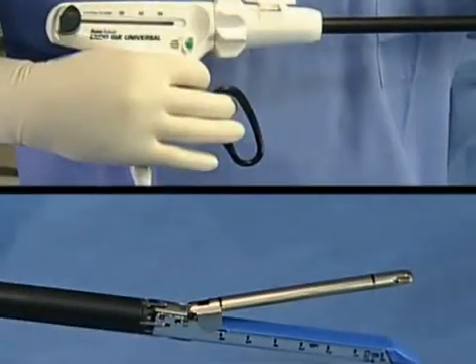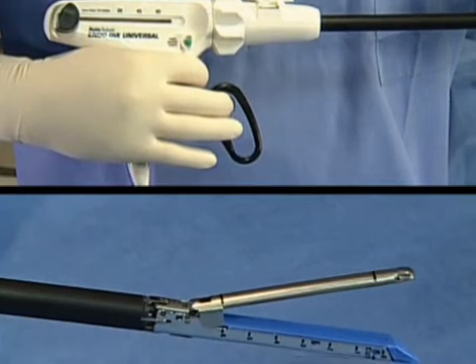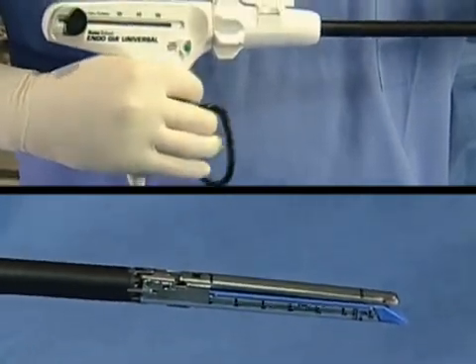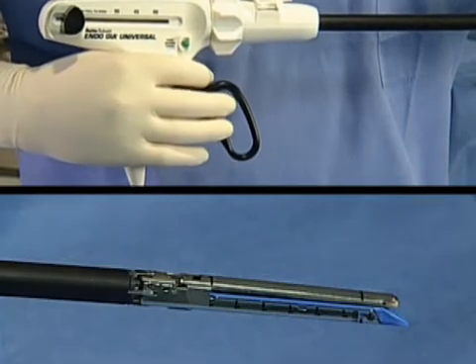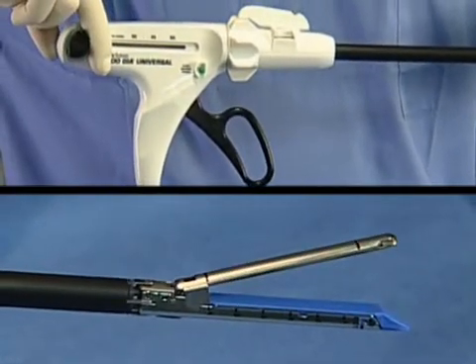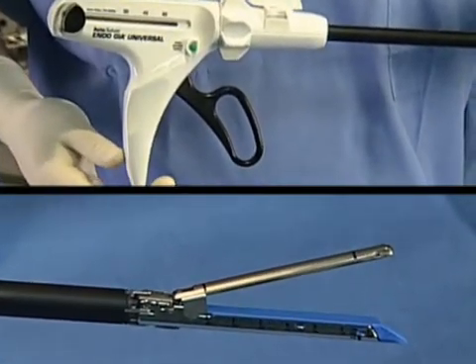You can validate that the EndoGIA Universal Stapler has been loaded properly by cycling the instrument. Squeeze the ring handle completely to close the jaws, then pull the black return knobs completely to open the jaws. Proper action of the instrument indicates that loading has occurred correctly.